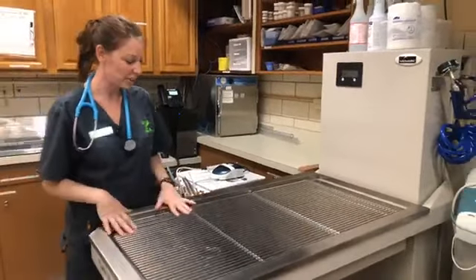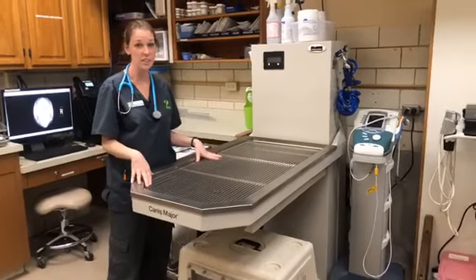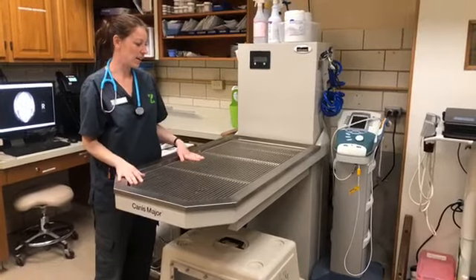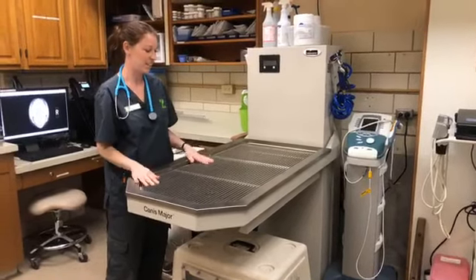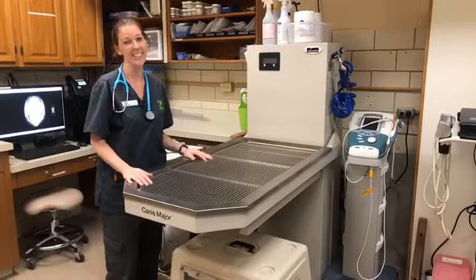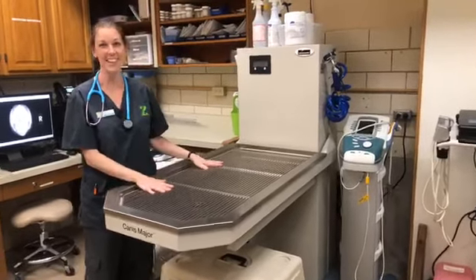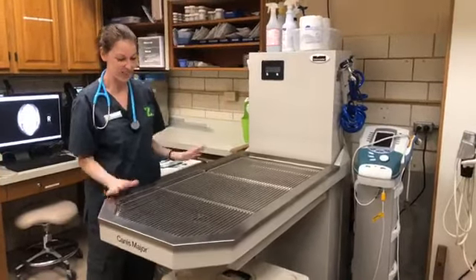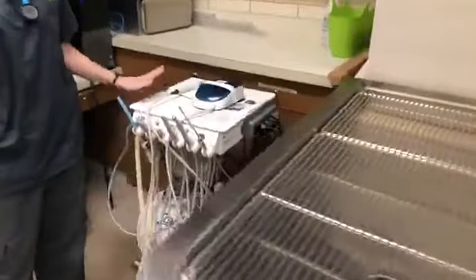This is our wet table. So in private practice, this would usually be used for dentals. So everybody, when they get their teeth cleaned, because it's really wet and messy, or abscesses, if we have to flush nasty wounds, like anything wet and gross that gets done here. We previously used this table on one of our colobus. He had some constipation issues, so he needed an enema, and so this table was a godsend, as you can imagine. And it also has a built-in scale, so this is a very handy little table. And then we also have a dental machine.